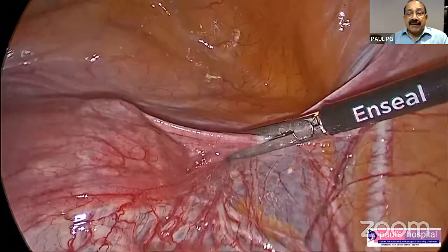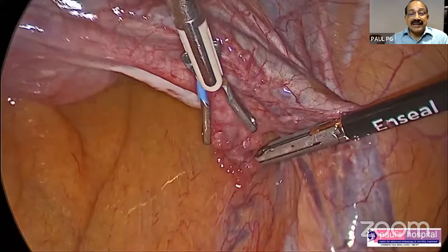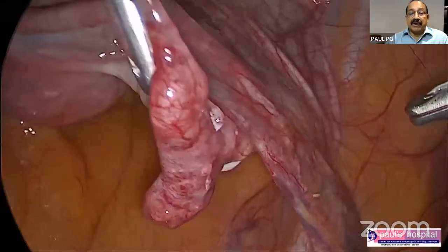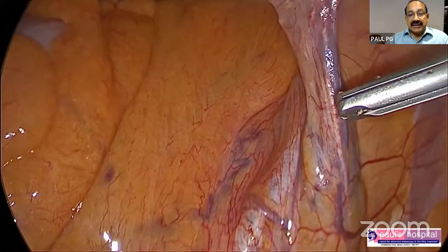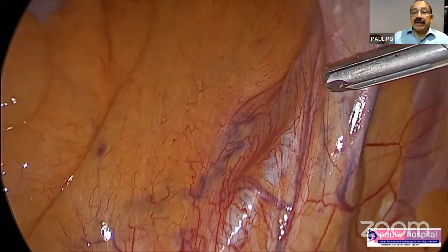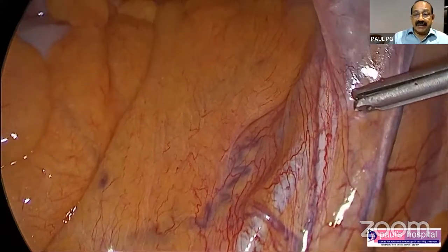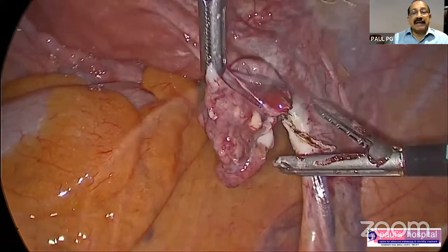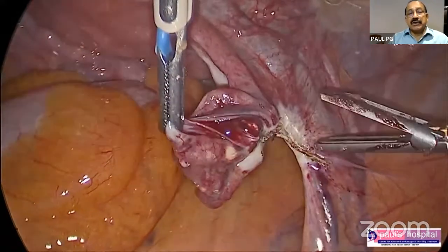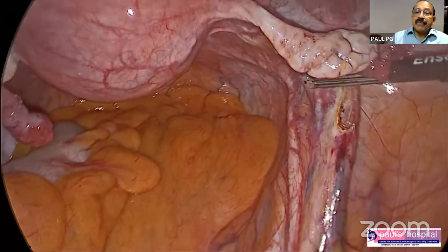When we started, we never knew how to do ureterolysis. So we mostly depended on, whenever we start the surgery, first trying to visualize. This should be done at the beginning of the surgery when the peritoneum is really transparent. You can see very easily on the right side, and the left side also. In the majority of normal anatomy patients, it's quite easy.